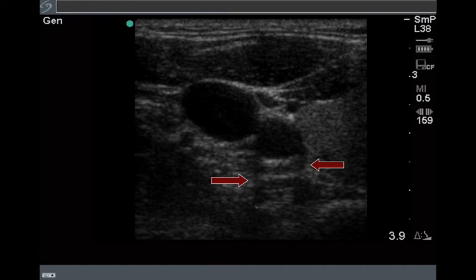So this little line here is actually an artifact, and that's because the edge of this round carotid refracts ultrasound away. In short, what you need to remember is behind a rounded structure, you often get two little black lines from either edge. That's artifact, and it's because of refraction.